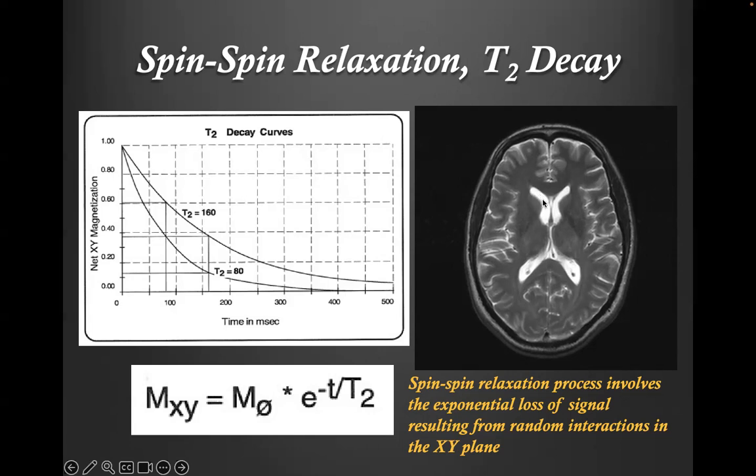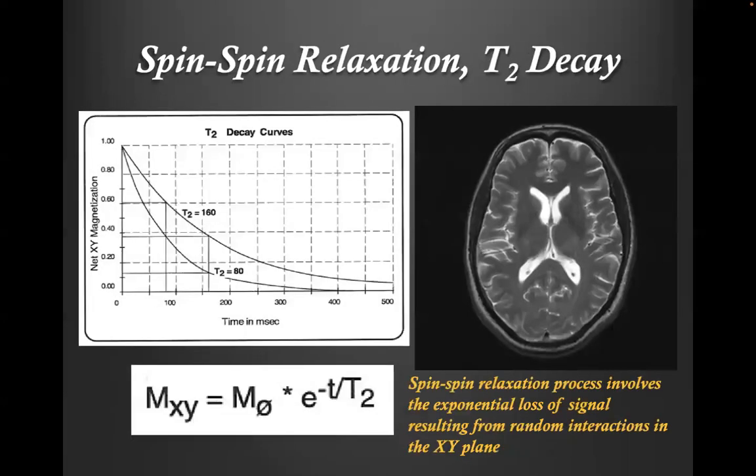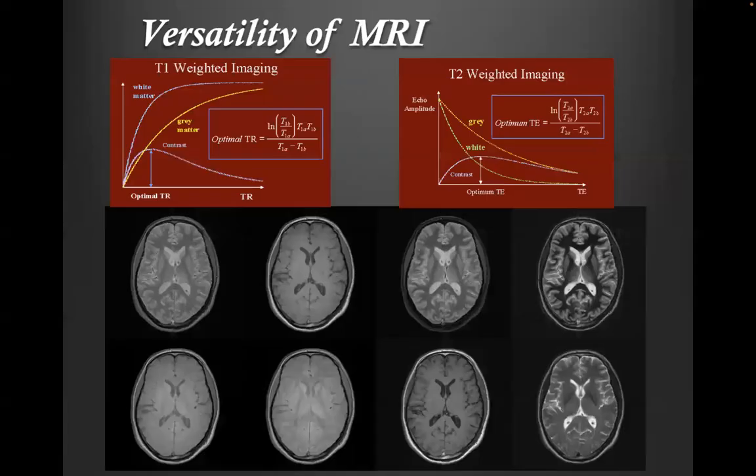And you can see that, previously, the T1 contrast actually gives you gray and white matter contrast. Gray matter will appear gray and white matter will appear whiter. And in the T2 weighted images, you are going to see most differences between CSF and other brain tissues. So your CSF will appear very bright and your gray and white matter will appear darker, but it's not a very clear differentiation between gray matter and white matter.